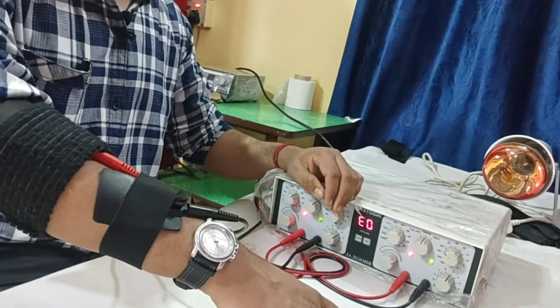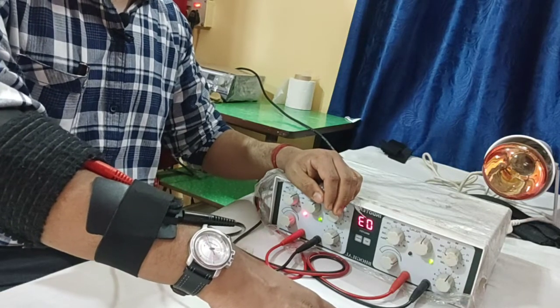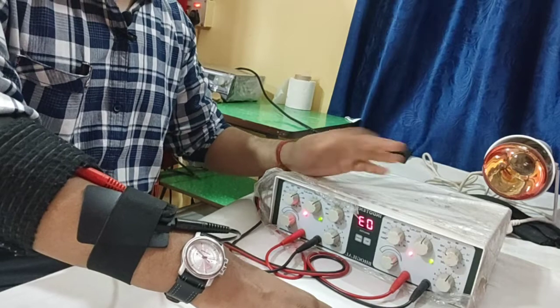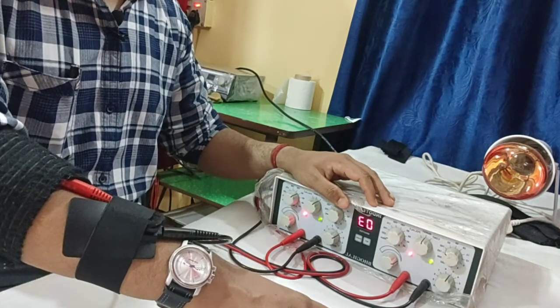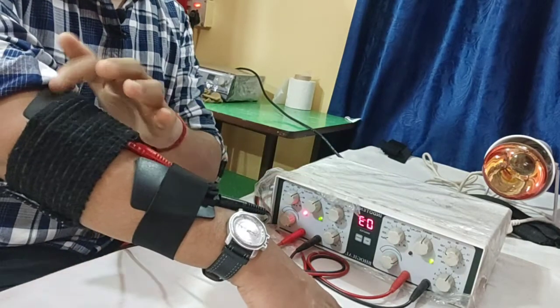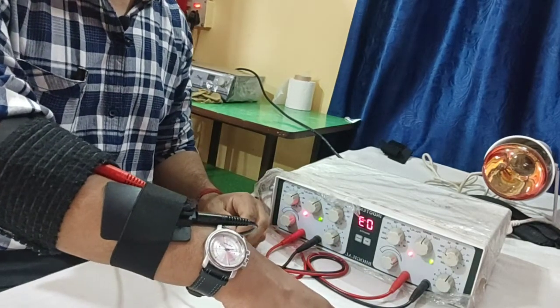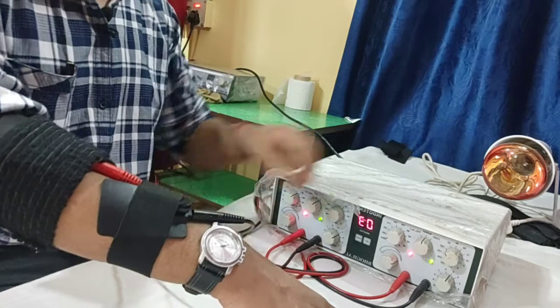a trigger point type of pain, or any type of localized pain, any spot area wherever there is a trigger point formation. That is the area wherever we use this acu-TENS or the acupuncture type of TENS. And again the duration is supposed to be 12 to 15 minutes for an acupuncture type of TENS.